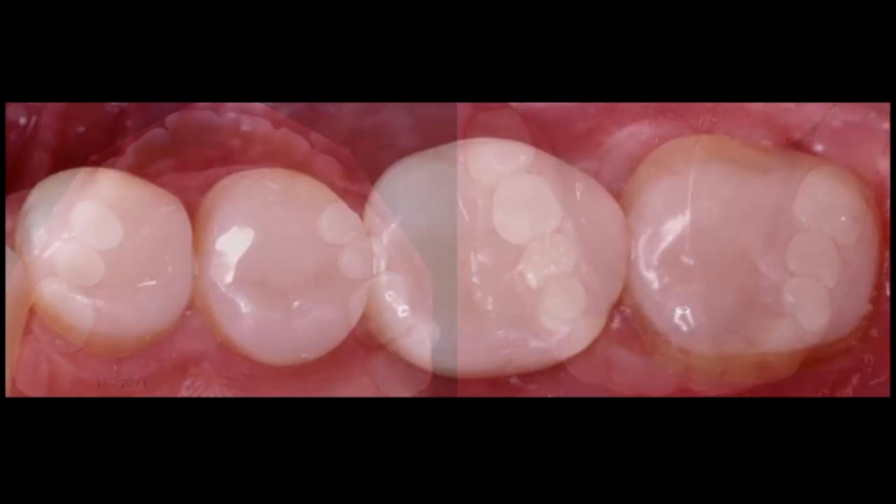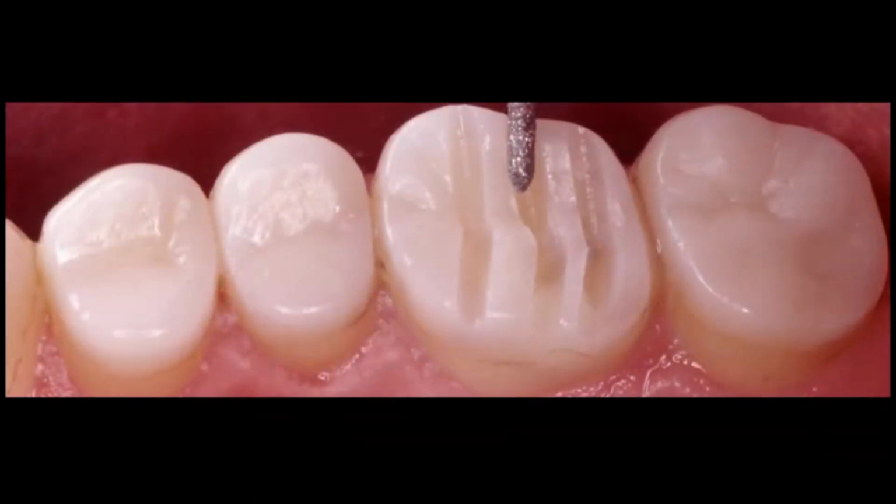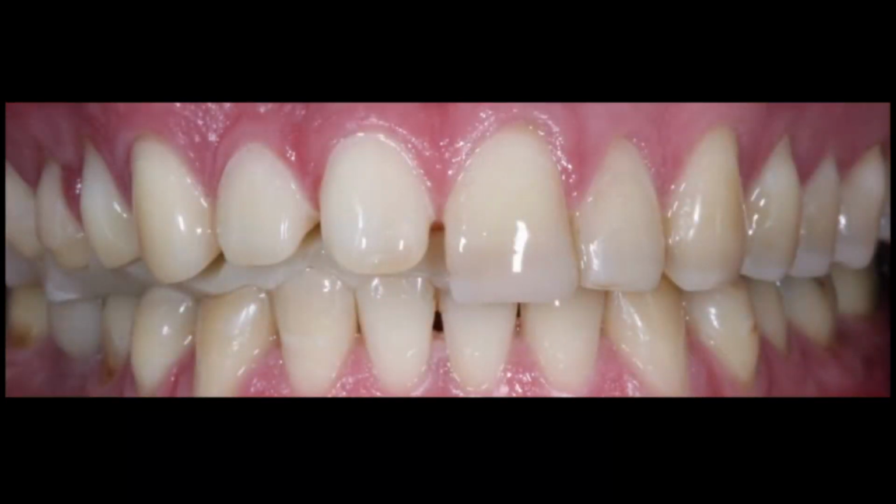I show you magnification, so we can say, please keep in mind, this material, Telio CAD, is good for 1 year. It's based on unfilled PMMA, and this, of course, shows a higher wear rate, like we will see later on, than composite-based or polymer ceramic-based materials. So finally, we changed that into the final ceramic. I had some protocol to follow: 1 millimeter thickness of the occlusal veneers. That was the definition for the study.